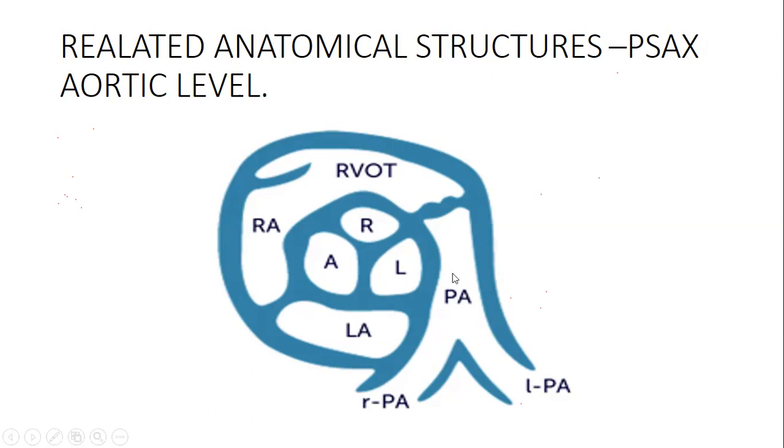So in terms of pulmonary stenosis, I'll come and show you. We'll see how these things come. Your job is to understand what the related structures are. Don't cram, but understand the orientation of the probe and how you are picking that.